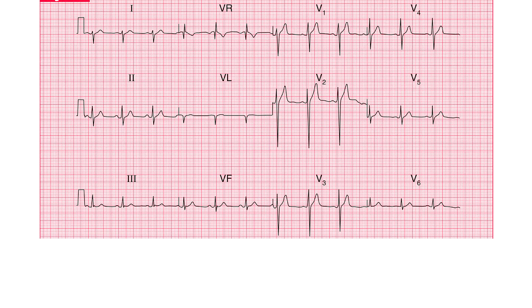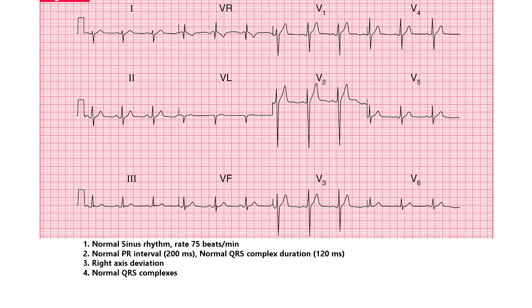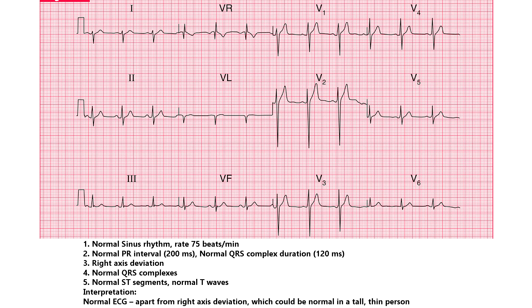Here is another variant of a normal ECG. It will be reported as: normal sinus rhythm, rate 75 beats per minute, normal PR interval, normal QRS complex duration, right axis deviation because lead 1 is negative, normal QRS complexes, normal ST segments, normal T waves. Interpretation: Normal ECG, apart from right axis deviation, which could be normal in a tall thin person.